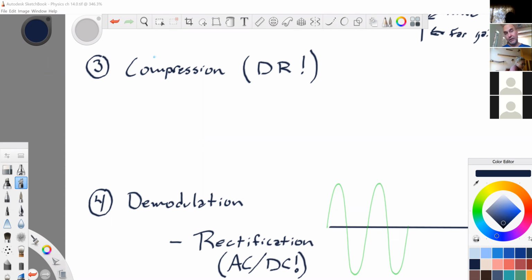Personally, with my dynamic range, I like a pretty high dynamic range if I'm looking at certain organs. It kind of depends on how well I'm seeing them as well. If I'm looking at a well-behaved infant, you can imagine infants are pretty easy to scan, I actually turn my dynamic range up pretty high because I like to see as many shades of gray as I can.